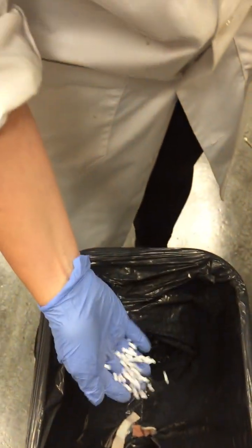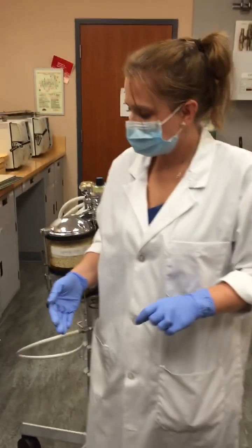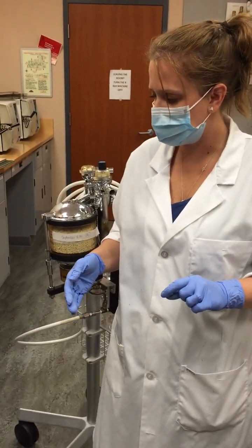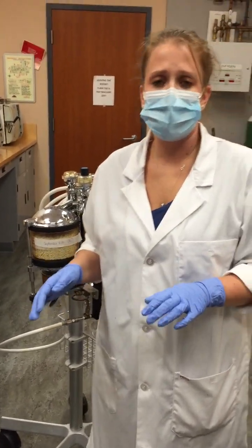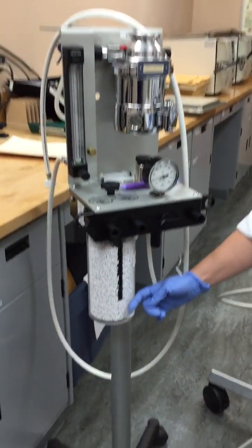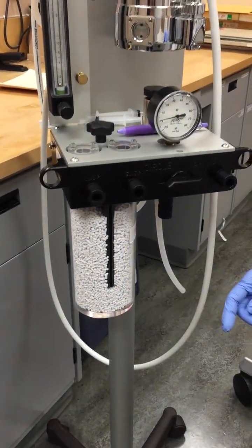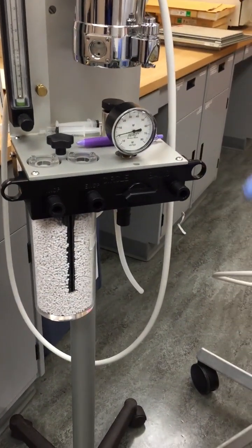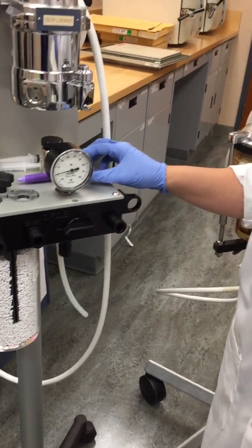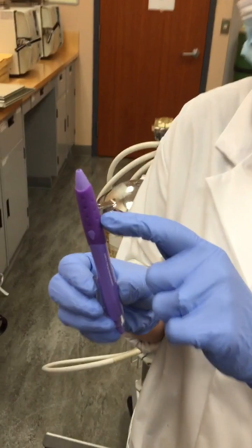They will also be a shade of purple when they're exhausted. Please note that when the anesthetic machines are in use, the granules may have a purple hue to them, but it's a very light purple hue. When they're completely exhausted, they're going to remain a shade of darker purple, very similar to the grip on this pen.